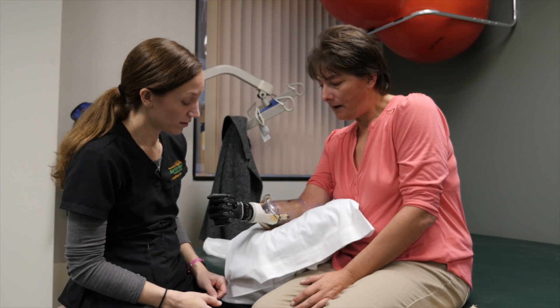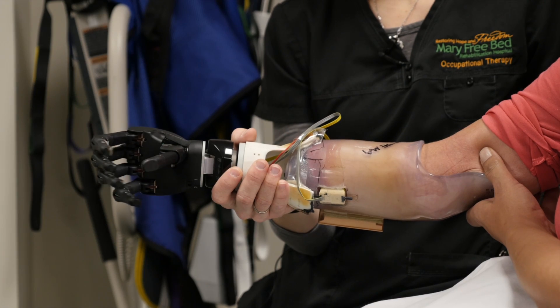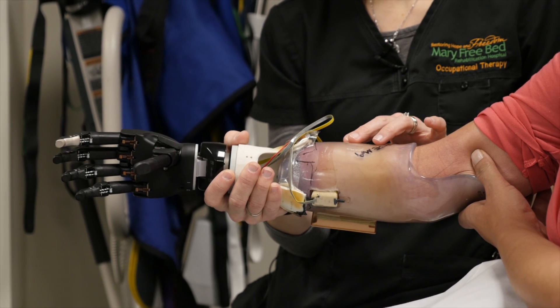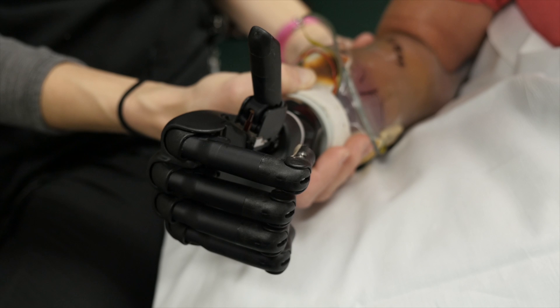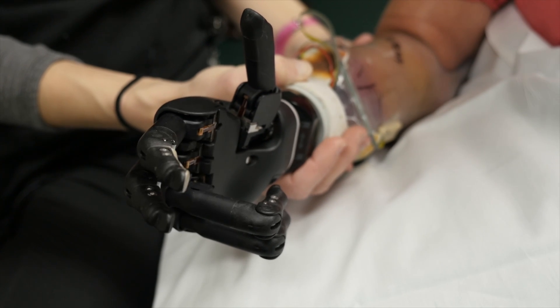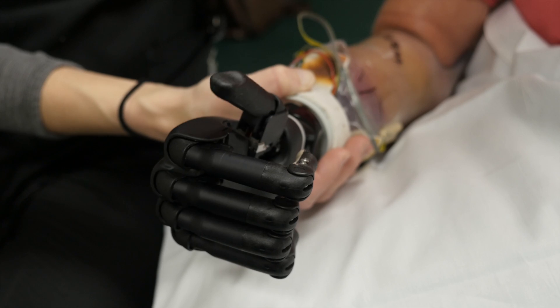Working it, making it work like a hand. I said my biggest thing that I want to do with it the first time is hold a pen and write with it — because I was right-handed and that's what I miss. I miss my penmanship. Right now we're still working on getting it to fit well, but it is the taking off that we're still working on.